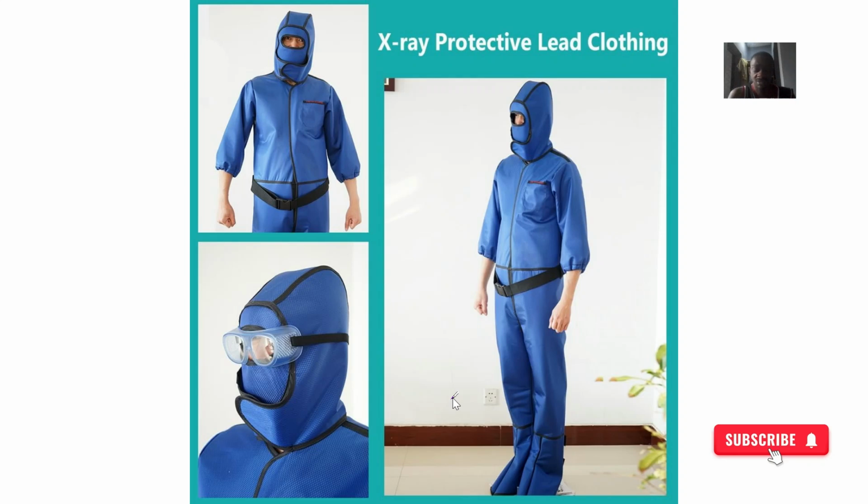All right, so this is another image where you get to look at what the PPE is. This one is X-ray protective lead clothing, so it's made from lead, and it's specialized for that role.